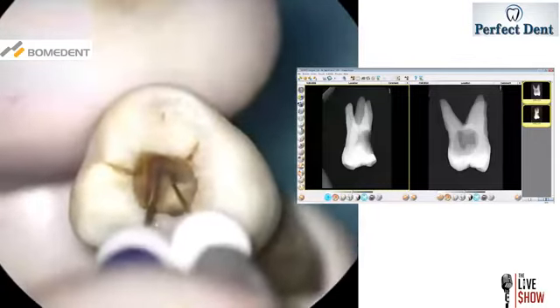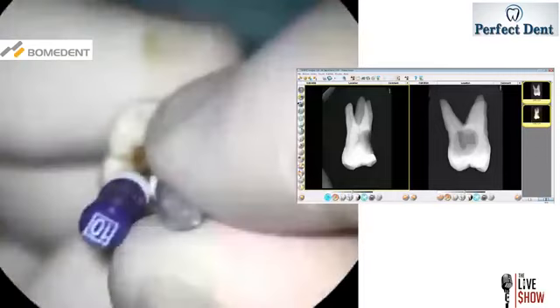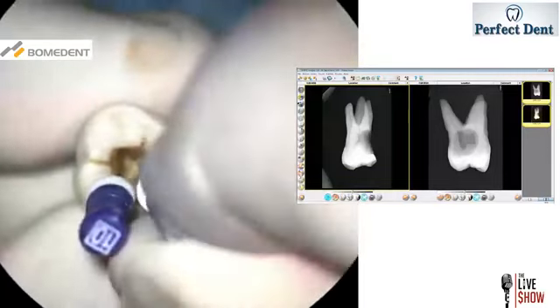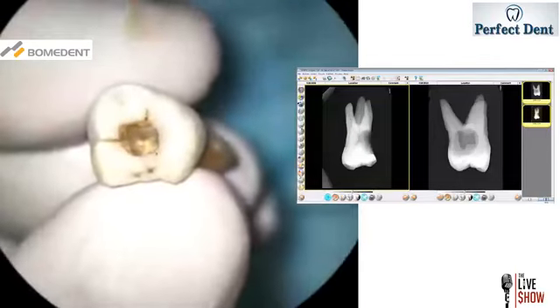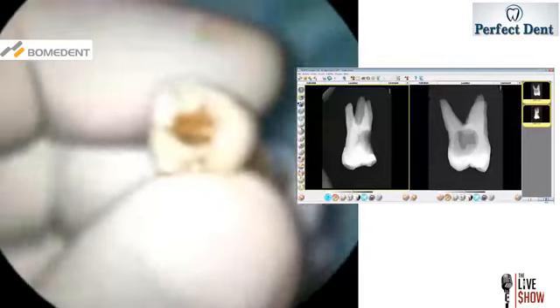So that would be your mesiobuccal 1 and your mesiobuccal 2. So you always look for extra canals. Definitely, there would be a time for discussion on how to find missed canals and the anatomy involved. That's a whole big lecture. It's not a small discussion for one day.